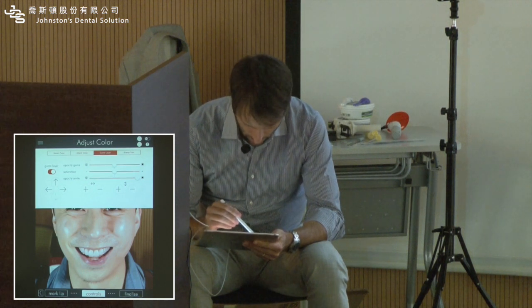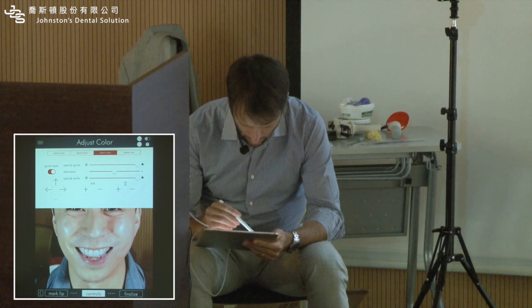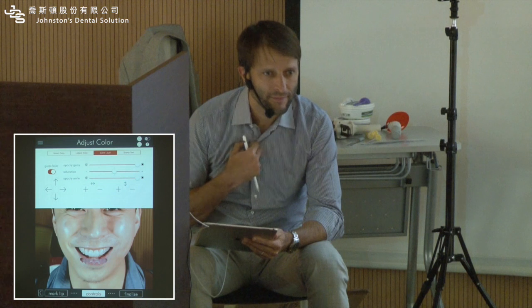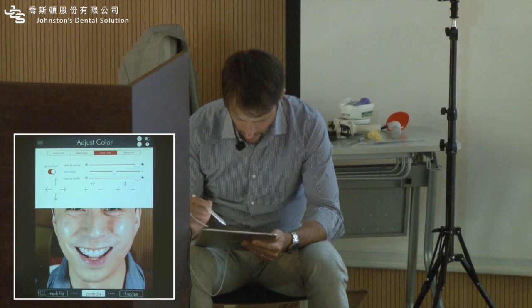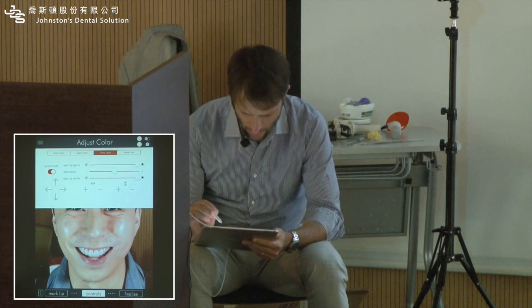So this is like a little piece of gum. That if the patient, somehow you want to show how gum surgeries or ortho or crown lengthening or artificial pink or orthognathic surgery or dentures.